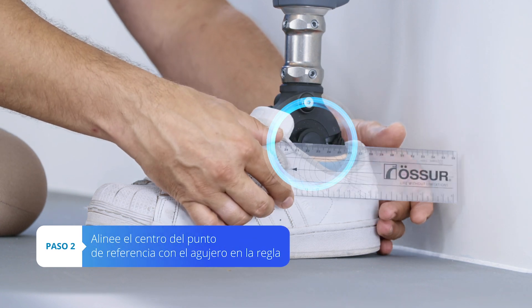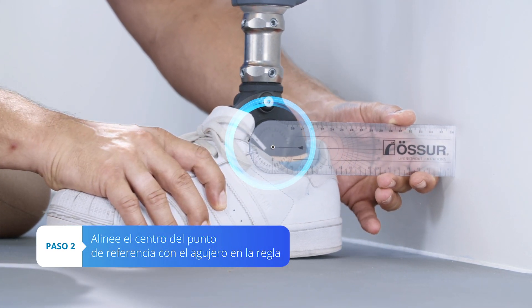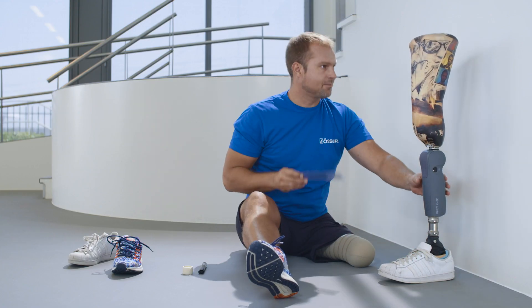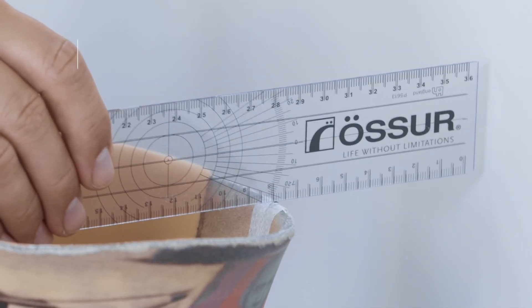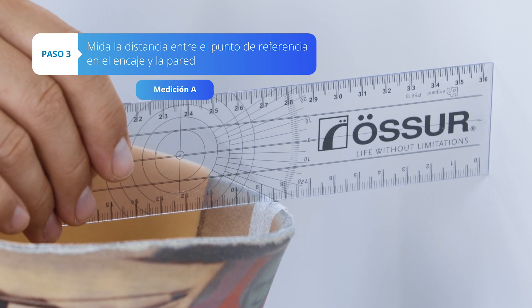Take the ruler and position the hinge hole over the ankle center and the flat end against the wall. Measure the distance between the reference point on the socket and the wall. Write it down as measurement A.